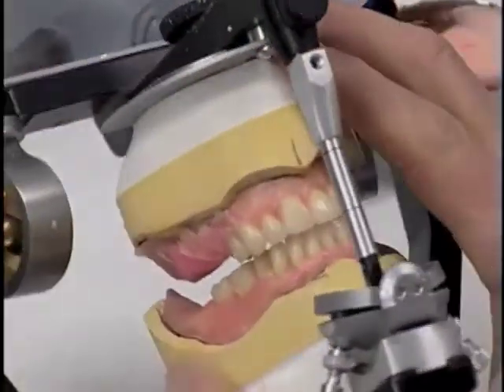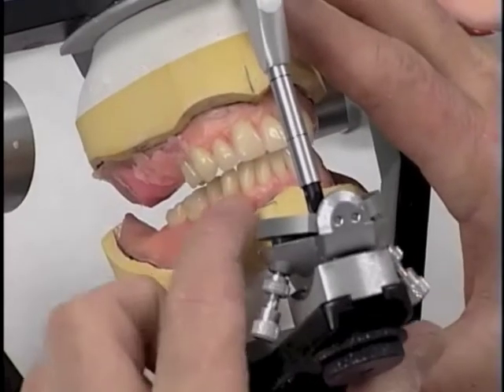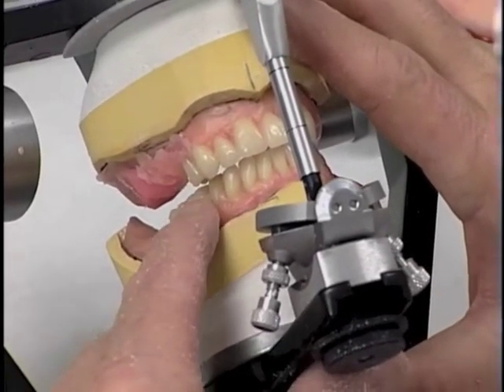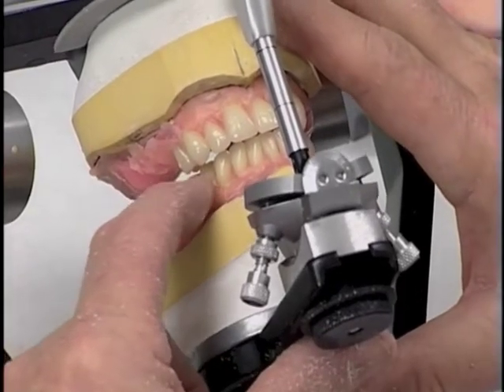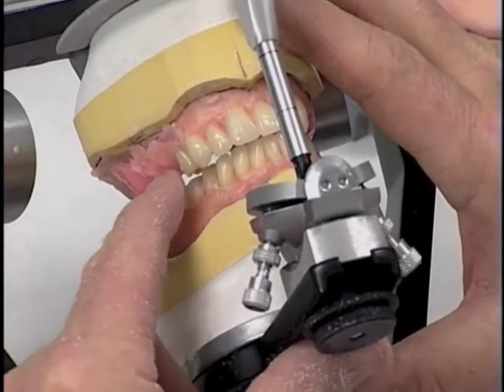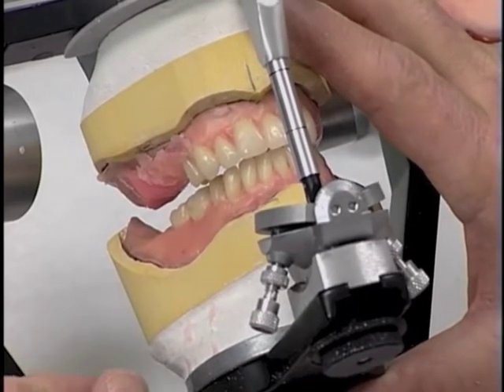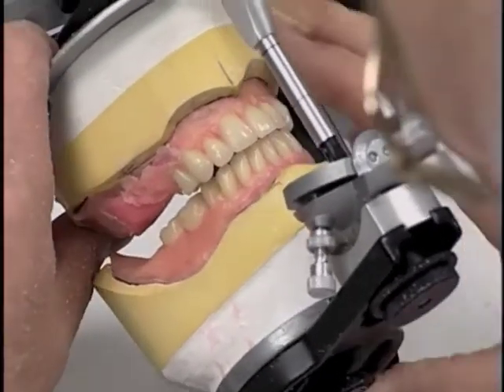That looks pretty good from here, because we have a little excessive horizontal overlap of the maxillary canine to the mandibular canine. We're going to end up with not much tooth contact on the first premolar, but that will come in with the first molars and second molars quite nicely. So we don't really have to worry about that.